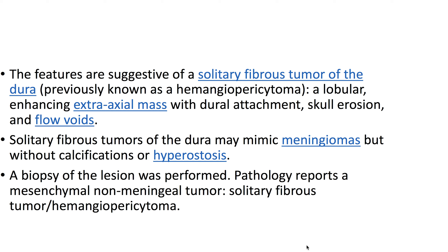The features are suggestive of a solitary fibrous tumor of the dura, previously known as hemangiopericytoma — a lobular enhancing extra-axial mass with dural attachments, skull erosion, and flow voids. Solitary fibrous tumors of the dura may mimic meningiomas but without calcifications or hyperostosis. A biopsy was performed; pathology reports a mesenchymal non-meningeal tumor: solitary fibrous tumor / hemangiopericytoma.